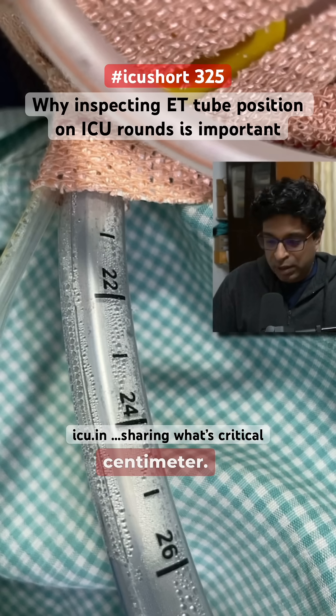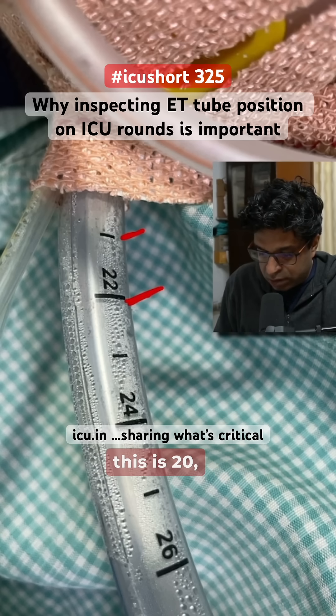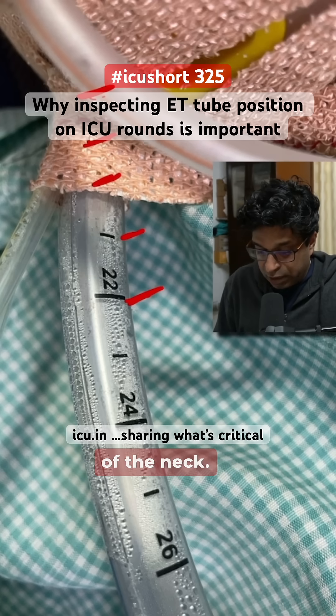As you can see in this photograph, this is the 22 centimeter mark, this is 21, this is 20, and somewhere around 19, 18, and 17. So it is somewhere between 17 to 18 centimeters. This tube can pull out very easily with the movements of the patient and movements of the neck.